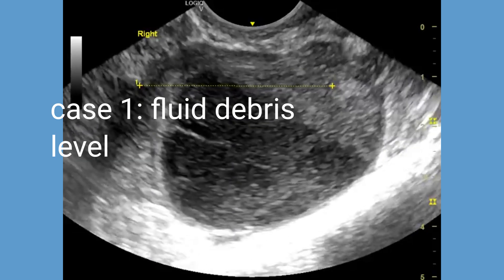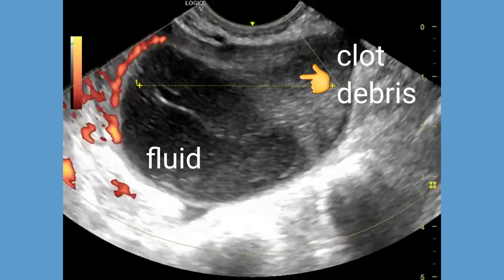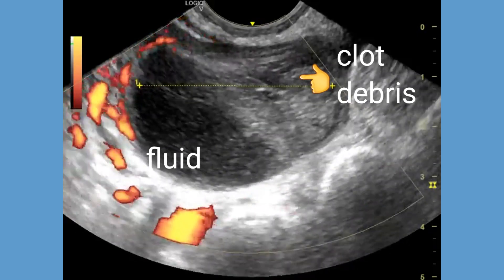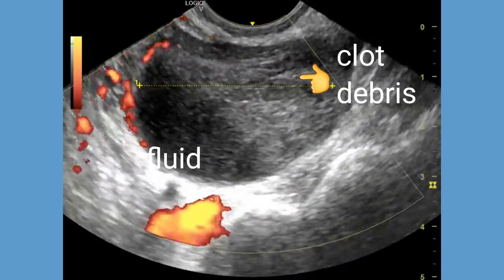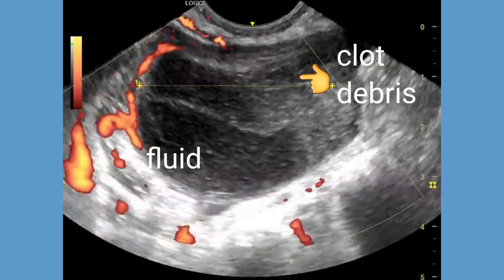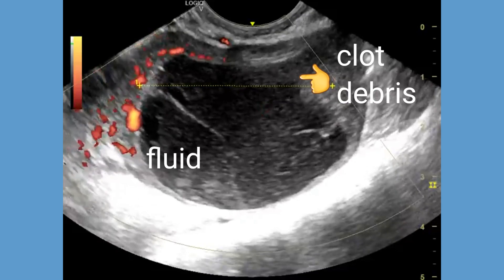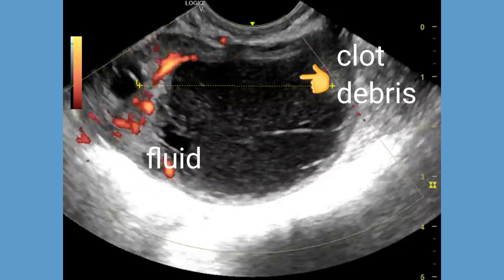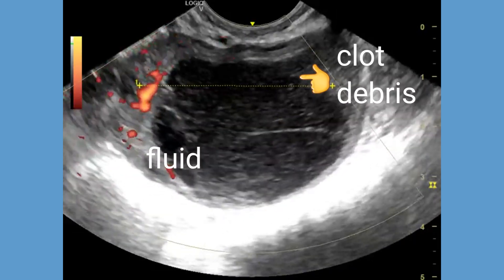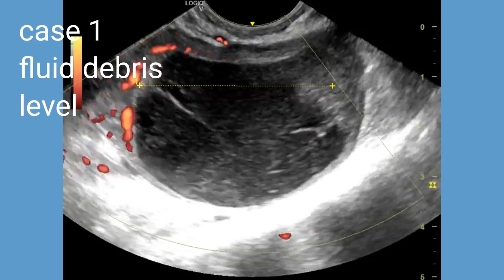The echogenic debris refers to the presence of a clot-like material within the cyst. The separation occurs due to the settling of blood components within the cyst, with the denser cellular debris settling at the dependent portion of the cyst due to gravity. As a result, you can see a distinct line or interface within the cyst where the fluid and the debris meet.